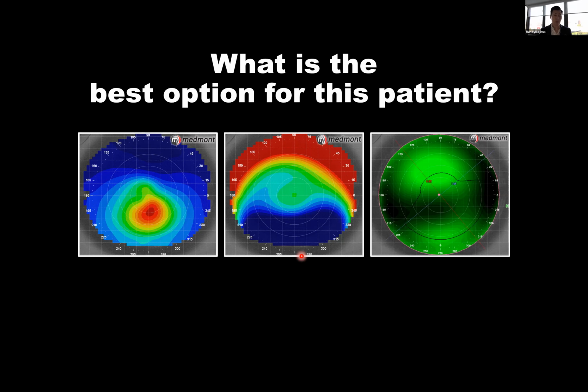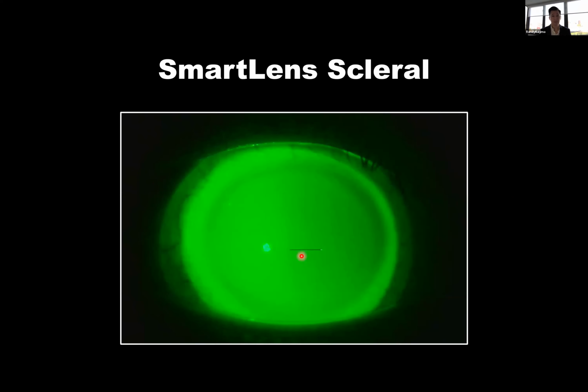And we know that corneal GP patients, an adapted wearer, can wear them forever. They literally wear them till they die. Thankfully, these lenses are so healthy for the cornea that we often find our corneal GP wearers wear them longer than our soft lens wearers do.